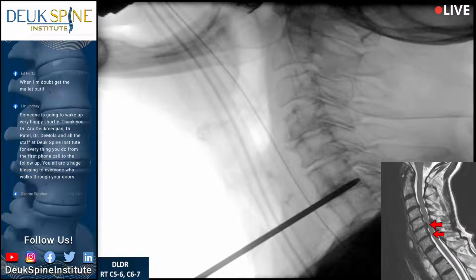This is wonderful surgery for people with osteoporosis or osteopenia because we're not fusing, we're not putting in a metal implant, we're actually doing a natural repair of the disc. The Deuk laser disc repair cures around 98% of the neck pain that comes from a herniated disc and about 98% of the arm weakness, pain, numbness, and tingling that people get in their arm from a pinched nerve.